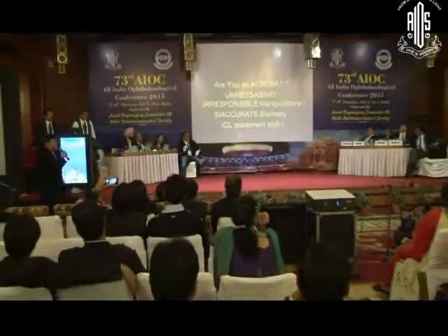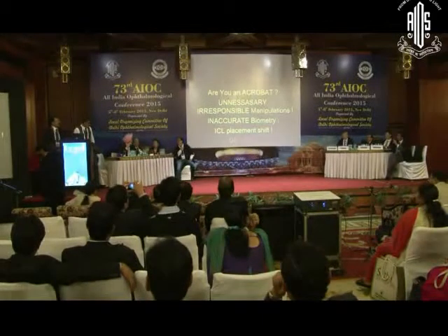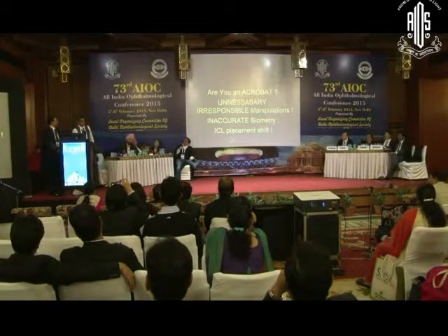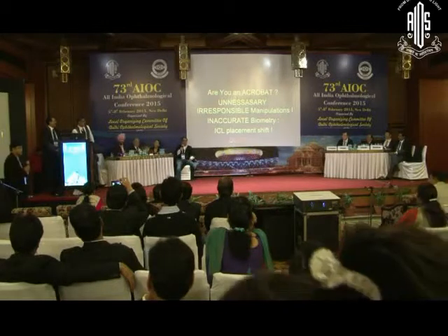Let us ask Dr. Rajsekar. Do you remember? One second, I think he has a femto laser. It would have been better to be less acrobatic and less heroic if you could. Sir, did you use femto, sir? You could have used a femto to do the capsulotomy. No, sir, this was before the era of femto.